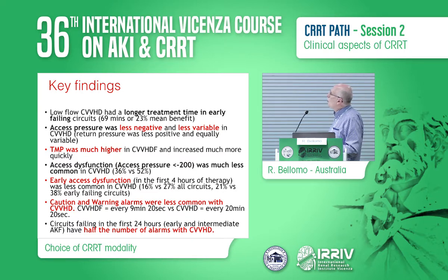But this is the cool thing. We just love this. You can download the alarms from the machine. I never realized how diabolical the number of alarms would be. So if you're operating CVVHDF, every 9 minutes and 20 seconds, the machine will alarm.